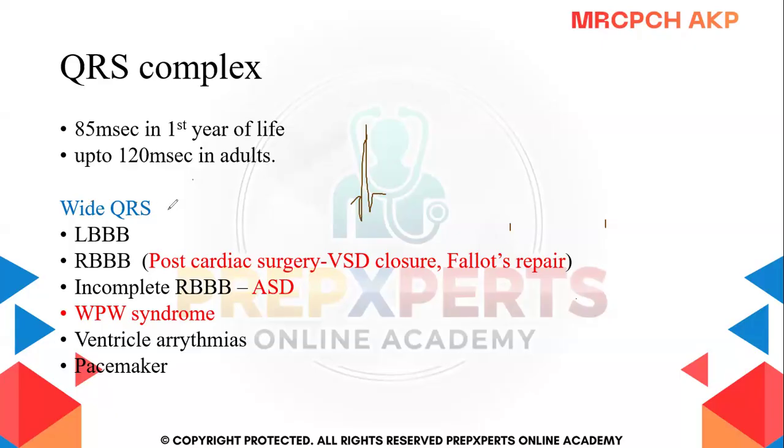Now, what is important regarding the QRS complex, that we should know which QRS complex is wide and which one is narrow. So we'll be discussing this in upcoming slides also. So I just wanted you to memorize in which conditions we are going to get the wide QRS, okay? Because the narrow ones are very few, and we'll repeat them again and again. But for the wide QRS, there are many conditions which are asked in the exam.